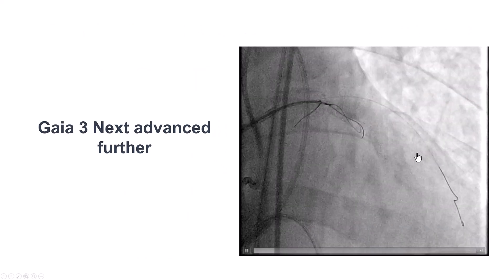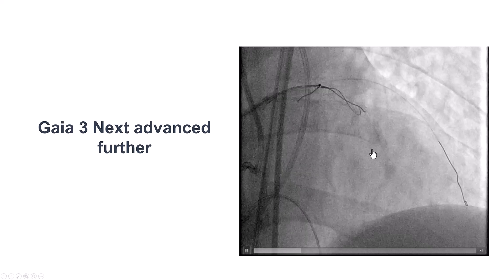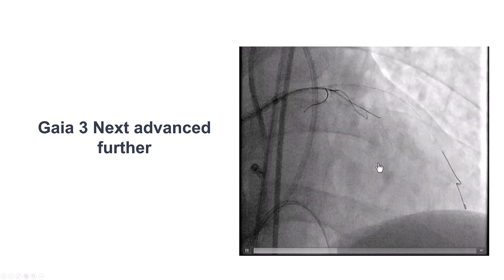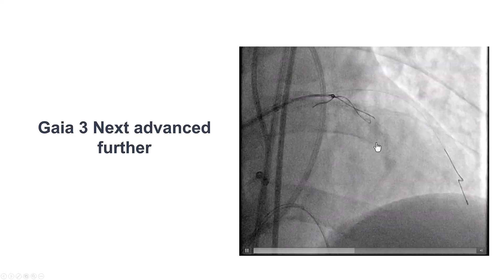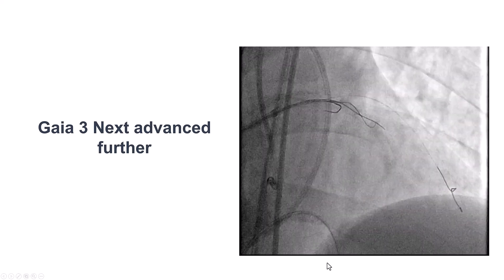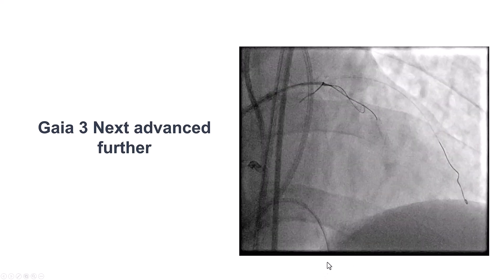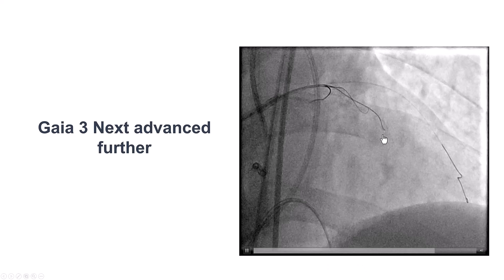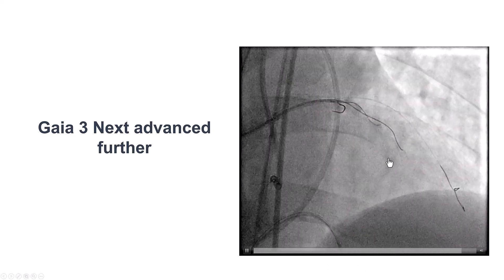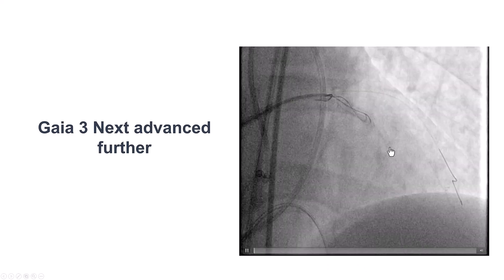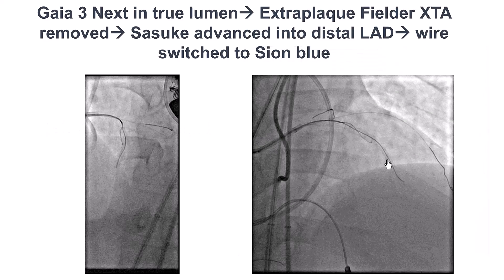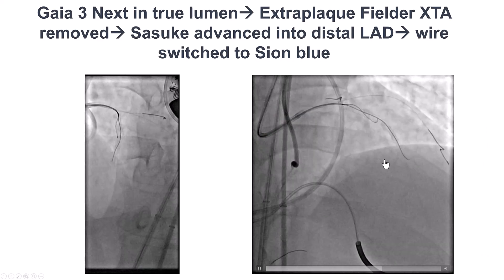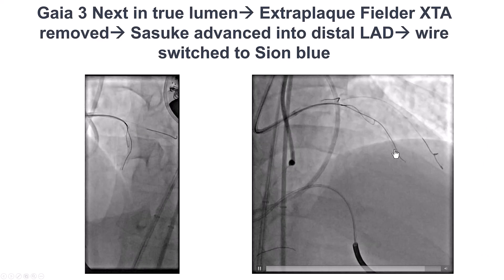And after some manipulation, we were finally able to advance the Gaia-NX3 guide wire that went further down into the LAD. The wire seems to be following the course of the vessel, and going through the previous stent is obviously fairly reassuring. This is a contralateral injection and sure enough, we have actually crossed into the distal true lumen.